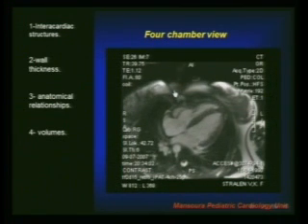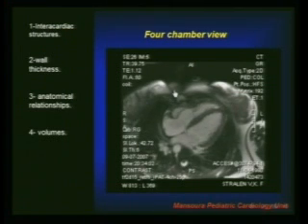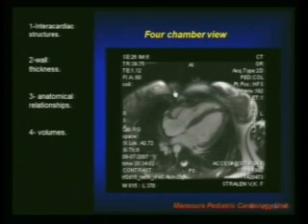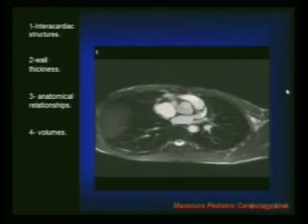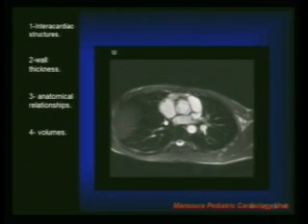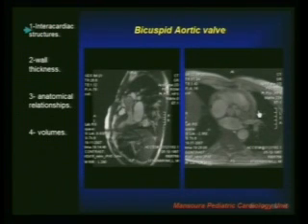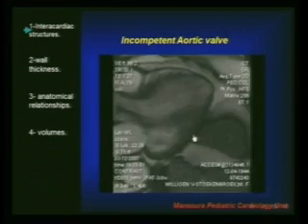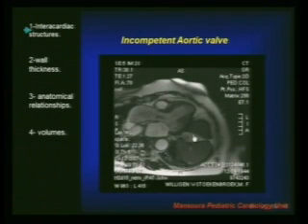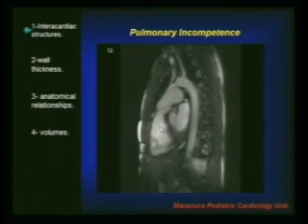This is a four-chamber view of a normal heart showing normal motion — the white blood technique in which blood flows beautifully throughout the chambers with no regurgitation, no stenosis. We can also identify structures such as the tricuspid aortic valve, and the bicuspid aortic valve with its regurgitant and stenotic lesion. Here is an incompetent aortic valve and a regurgitant dilated ascending aorta, as well as an incompetent pulmonary valve.